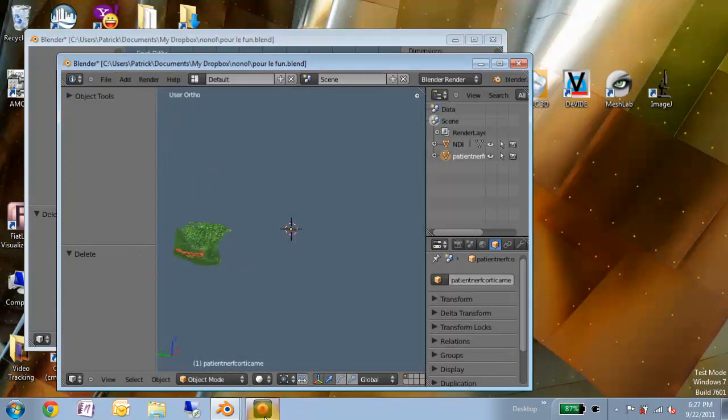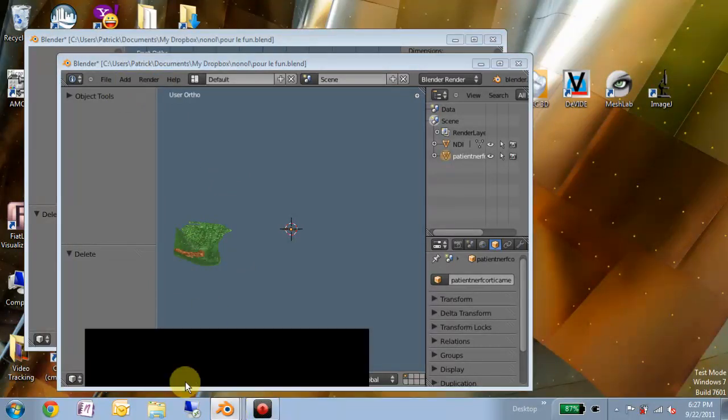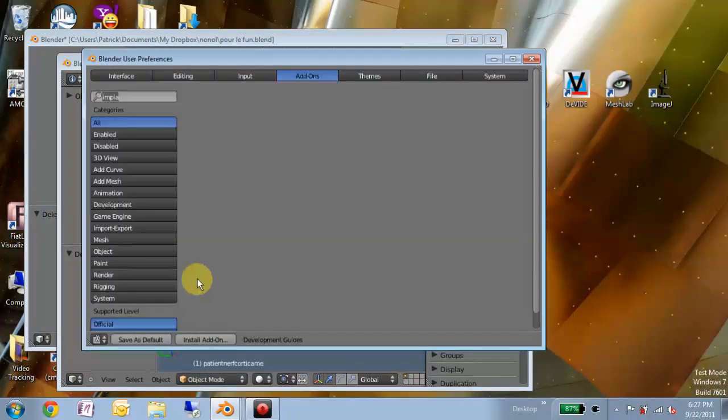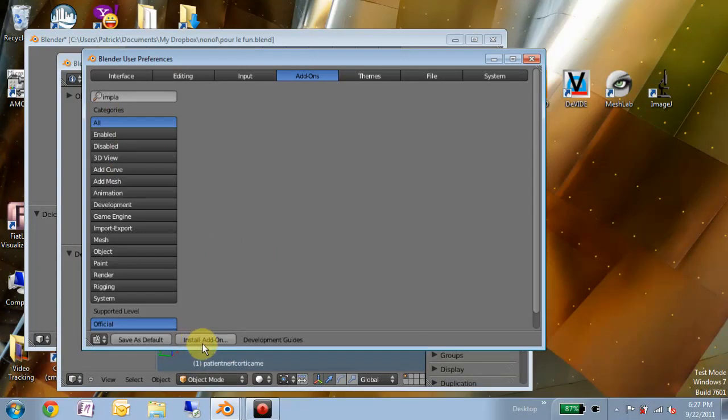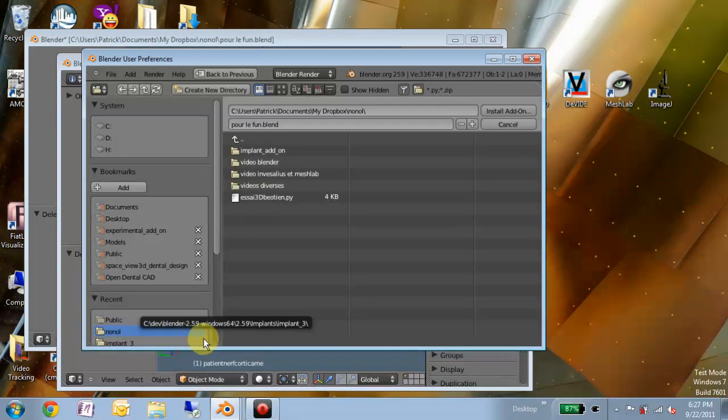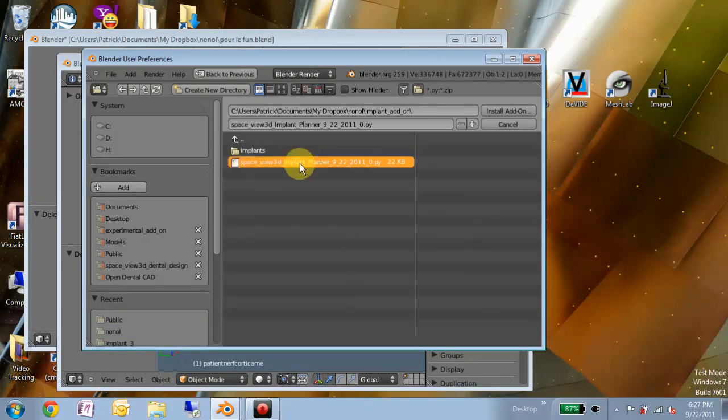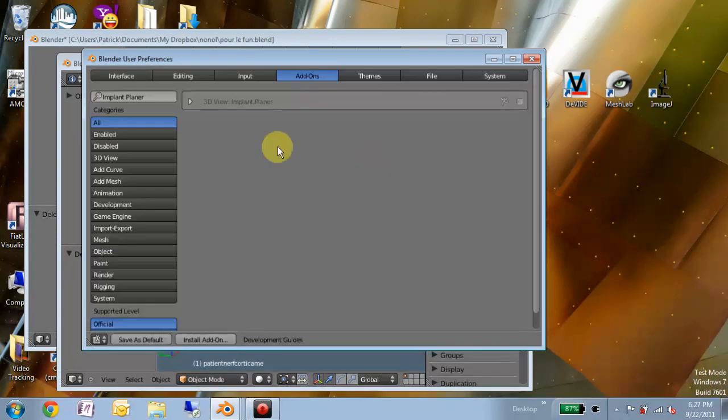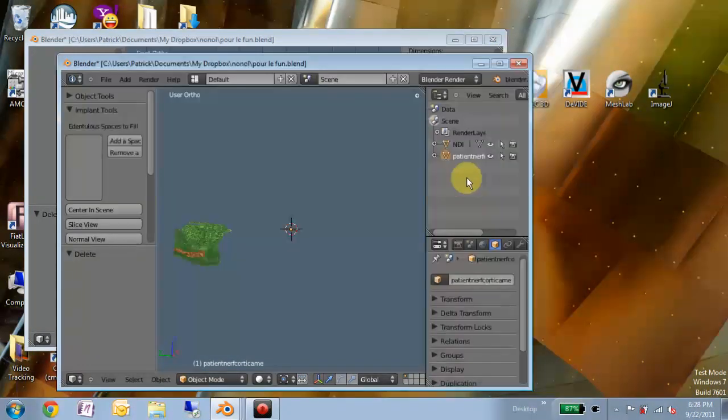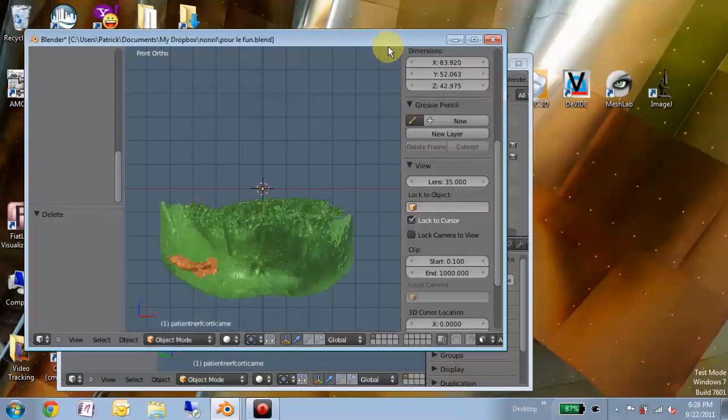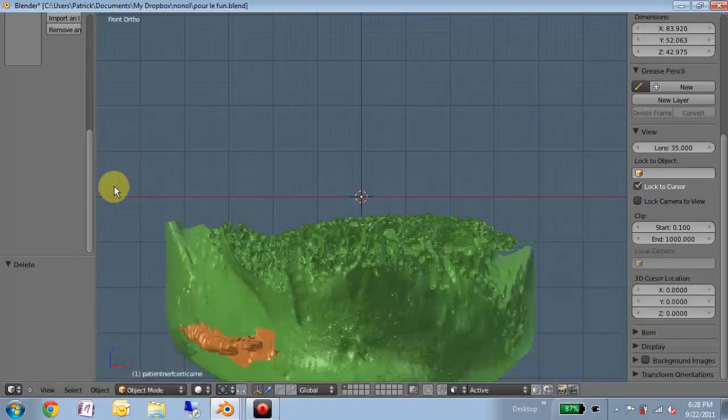So the first thing I'll do is enable the add-on.